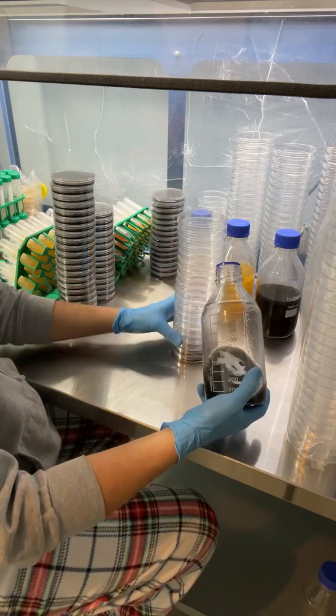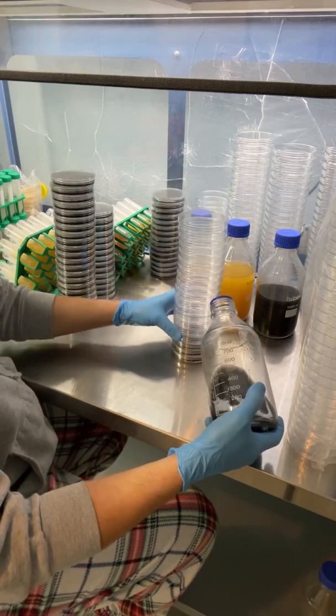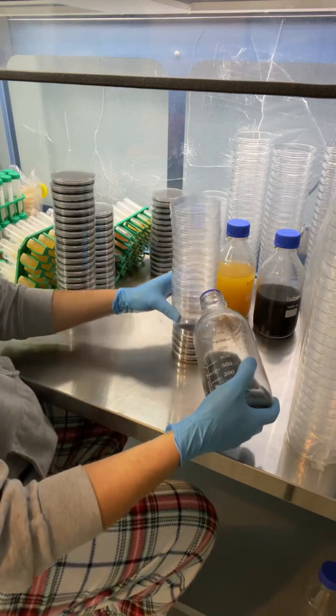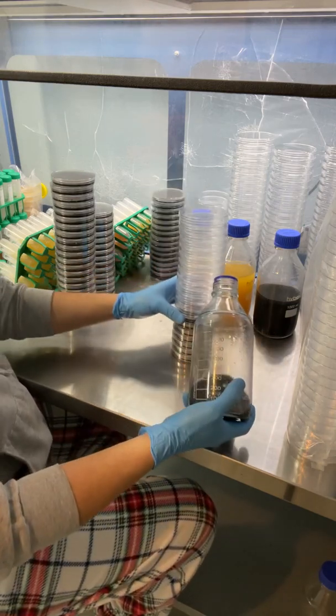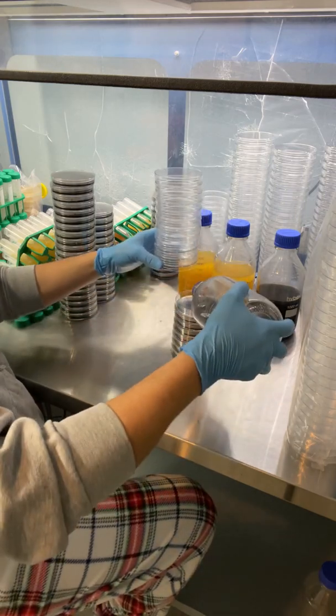I first tried out the black charcoal when I was doing some tissue culture and we were having problems with a plant releasing exudates as they were developing their roots. So we switched over to the black charcoal and it definitely was a problem solver to help keep the pH more stable.